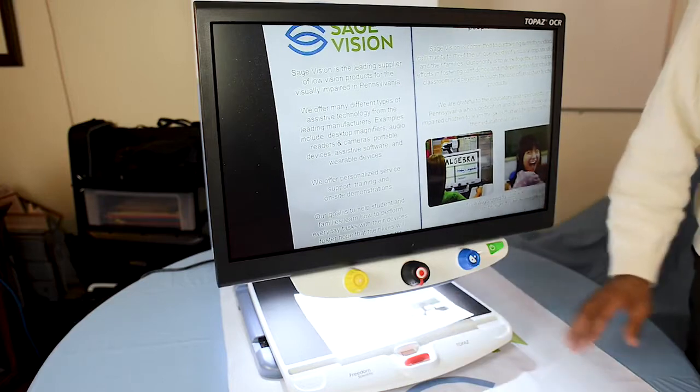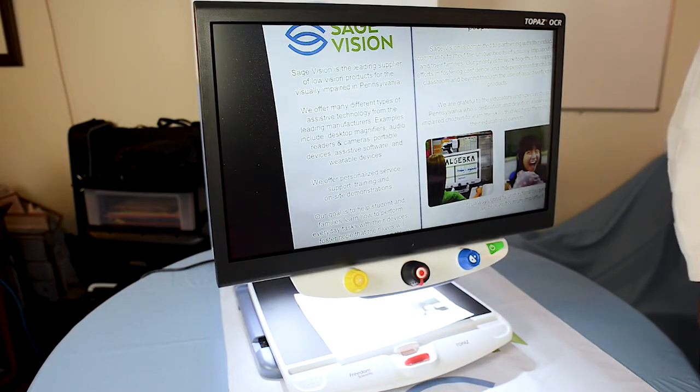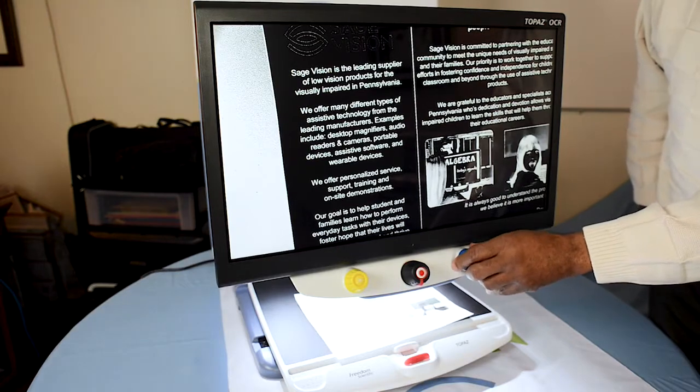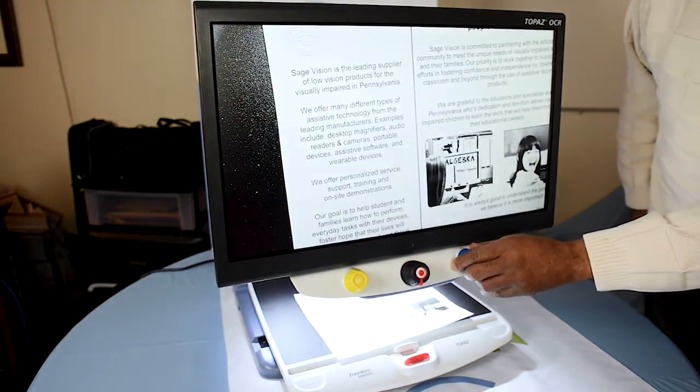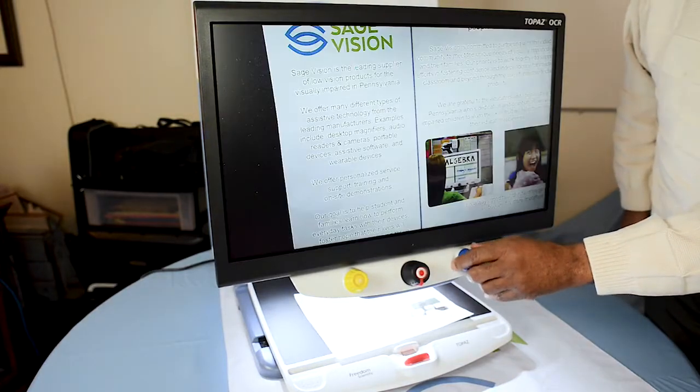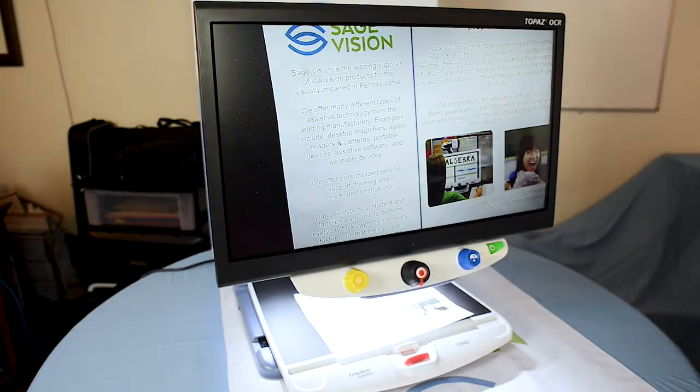It really just depends on the eye condition and the person as to what their preference is. There's black on white, white on black, colored blue and yellow, yellow and black, and back to normal color. There are a lot of different options you can use depending on your eye condition or simply your preference.